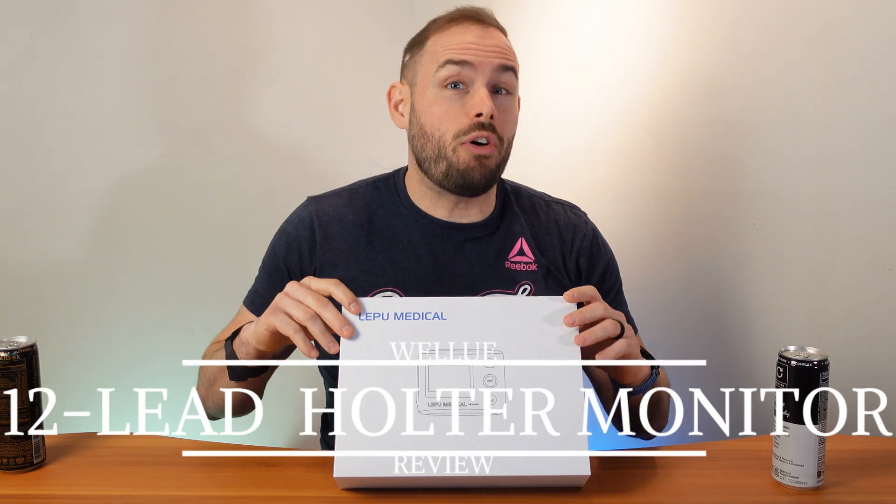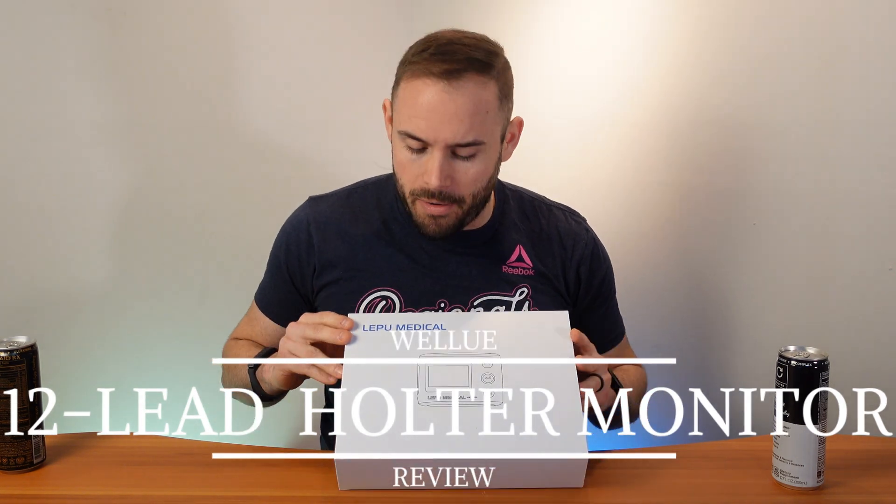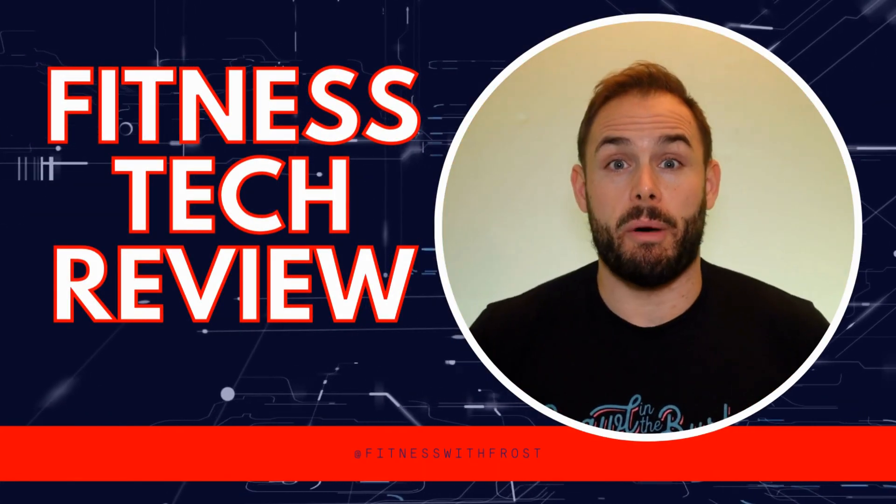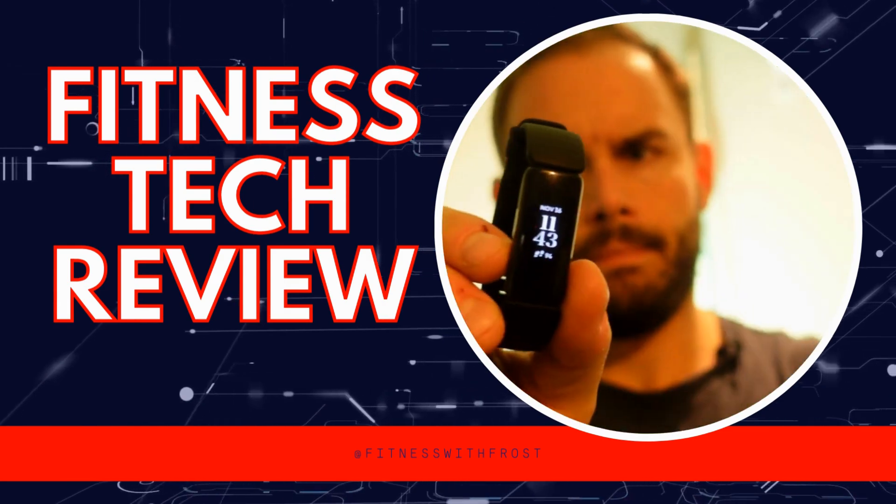What up everybody, welcome back to the channel. Today on Fitness Tech Reviews we're going to be going over the Well You 12-lead Holter monitor. This is something you're able to have on your person, checking out your heart rate and even ECG levels, and you can send all this stuff to your doctor. It's relatively portable, but let's see if it's right for you.